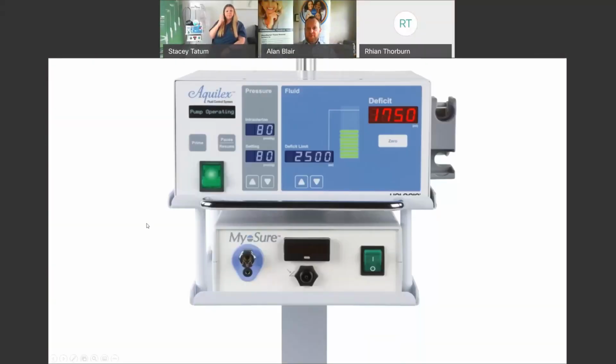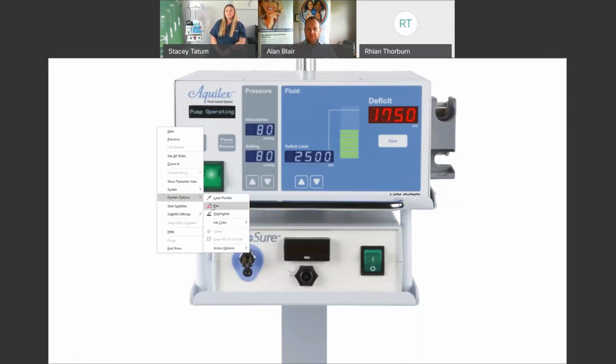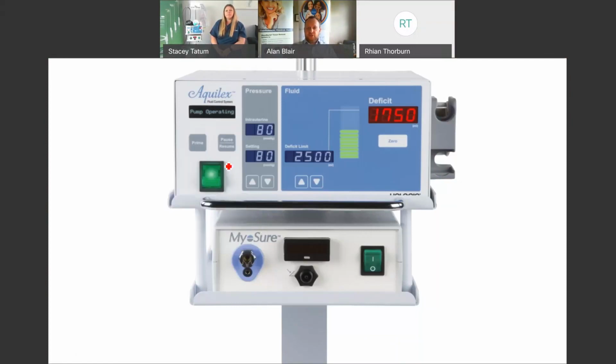Thank you, Stacey. Okay, so hopefully you can all see the image of the Aquilex system with the MyoSure controller below it. I'm just going to try and get a pointer for you so I can explain some bits and pieces. So with the Aquilex pump system itself, one of the key things to be aware of is we have this window here. And this window is really useful throughout the procedure and even when setting up, because it will give you information here as to what the machine needs, or if there is some alarm going off or a ping to alert you, then have a look on the window here and just identify what it's saying, because this will help you throughout the procedure.